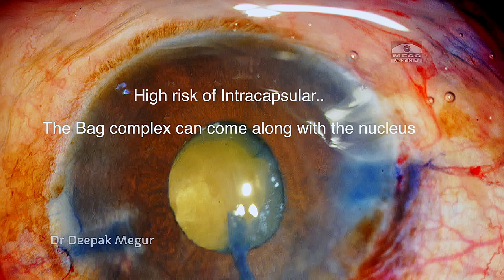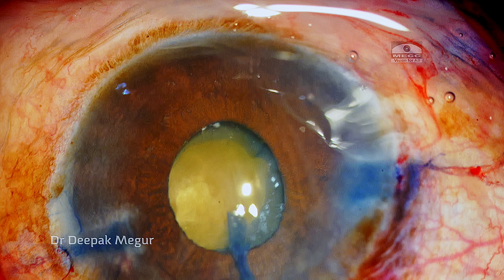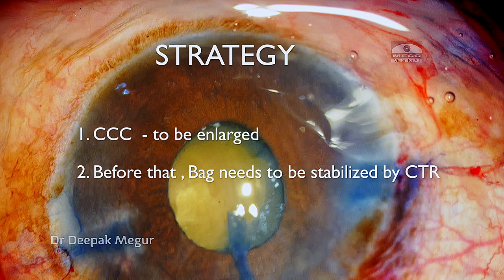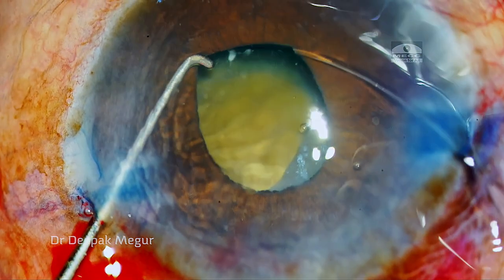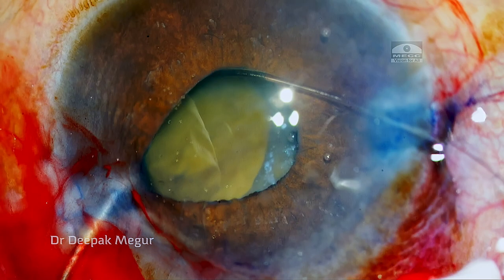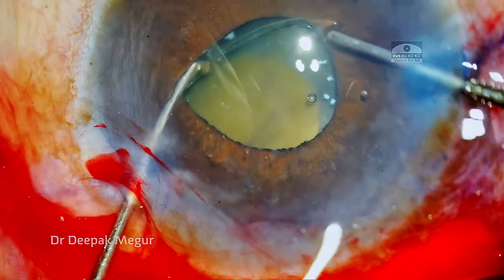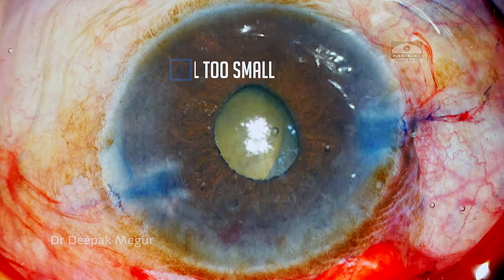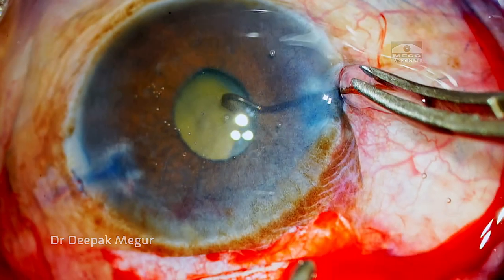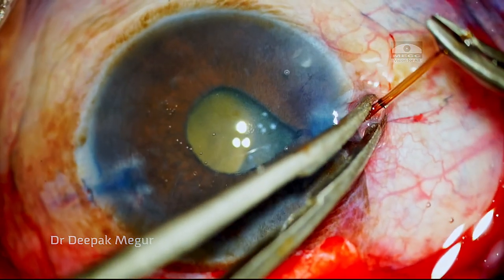There is a higher risk of inadvertent intracapsular extraction if I proceed with nucleus maneuvering with this sized rhexis. I desperately need a bigger rhexis, but I could only perform it after stabilizing the bag with the CTR. I'm finding it difficult to insert the CTR because of the small pupil. After a couple of failed attempts I managed it after retracting the pupil with a Sinski hook. Now the pupil has gone very small and I can't see well enough to do a bigger rhexis.